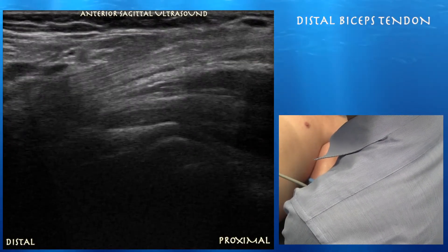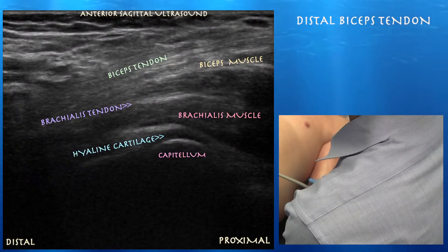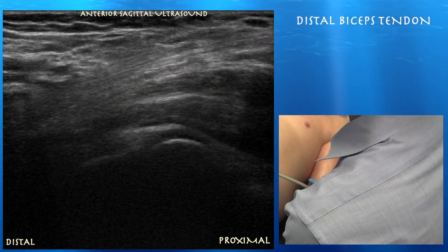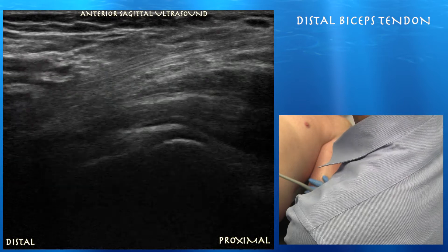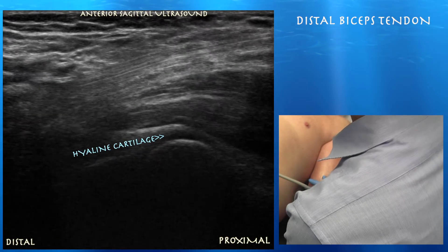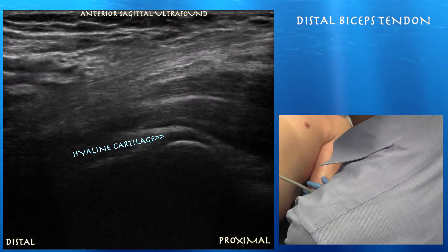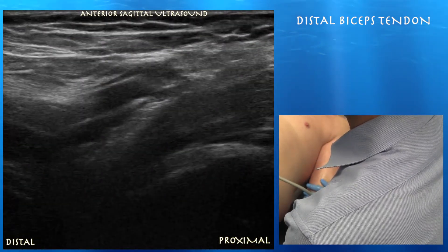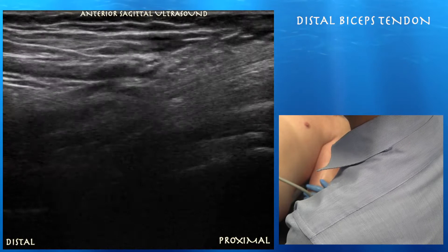Here we're going to go over looking at the distal biceps tendon. We're looking in an anterior sagittal plane where we can see the biceps tendon overlying the brachialis muscle. You can also appreciate the thick layer of hyaline cartilage over the capitellum. We're going to try to follow that tendon distally.